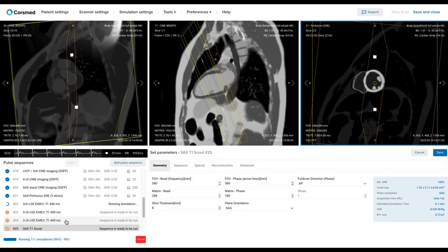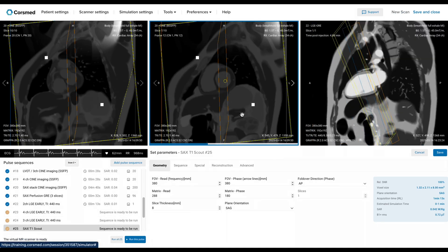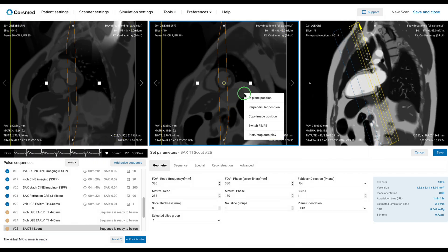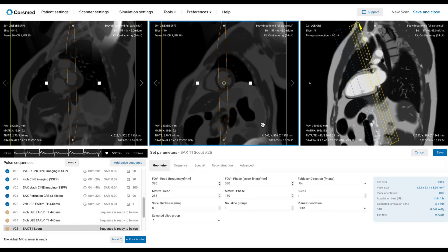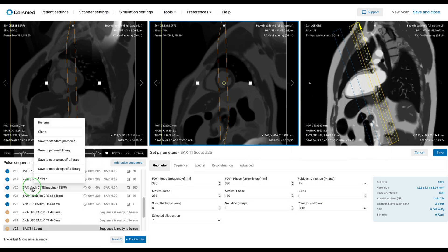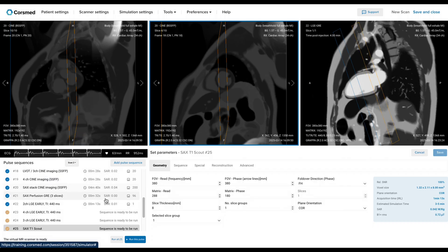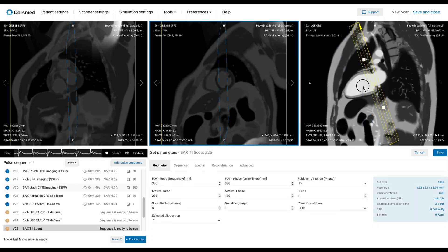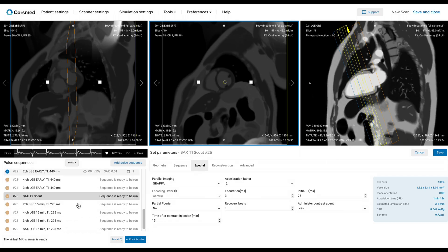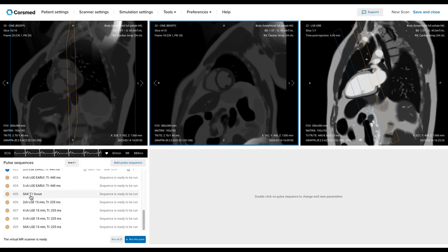To plan the TI scout, it's good practice to copy its position from your Cine slices. I'll scroll through the slices and pick one in the middle. Alternatively, I can right-click on the sequence down here and select 'copy center slice.' Then I'll center our slice package here. Now let's save and run our early four-chamber sequence.